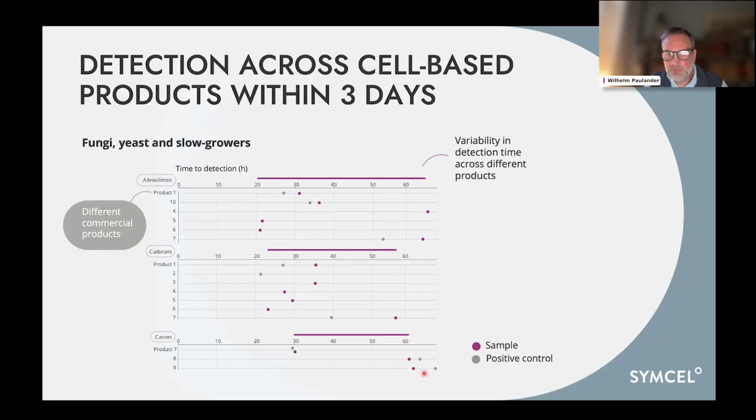When you look at C. acnes, that is the rate-limiting organism, you can see that basically in this case, there's no or very little effect between the product and the positive control. Even here in 2 cases, the positive control is slower. This is just an effect of a different amount of CFU. So if you aim for below 10 CFU, as it is in all of these samples, the distribution of cells can be quite large between some of these samples.